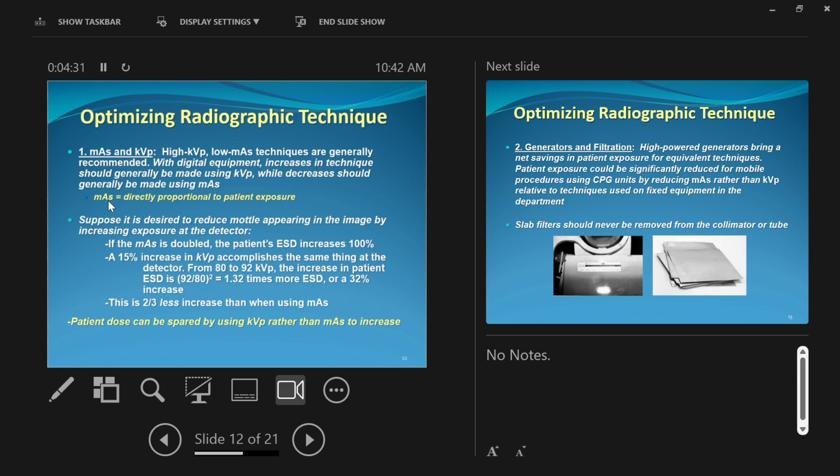Now, when you use a caliper, make sure your patient's standing, not laying down. When we lay down, we tend to kind of flatten out a little bit. Also make sure that you're not pushing this caliper into them, squeezing them. You just want to bring it to where the soft tissue is. Okay, let's go ahead and do this. Right about the belly button level. I'll bring the caliper in, take it out, and we have him right at 26 centimeters A to P.